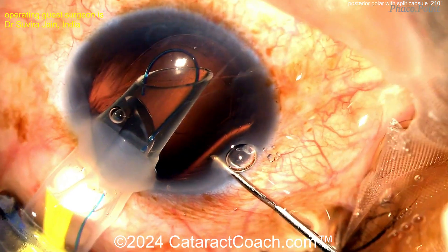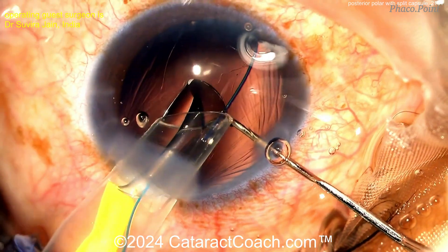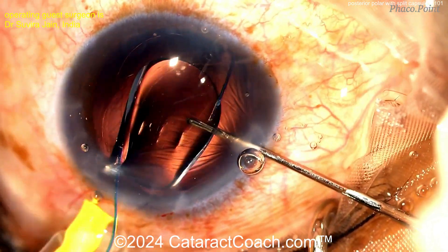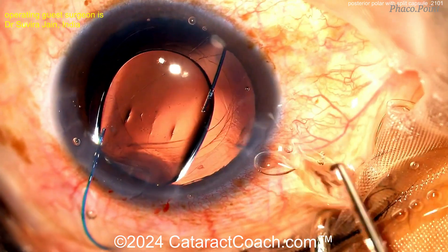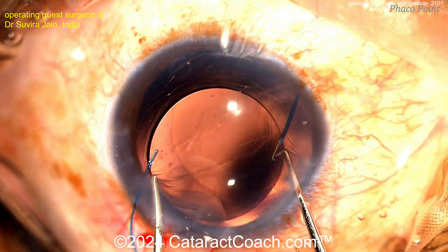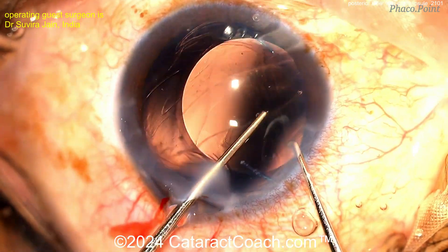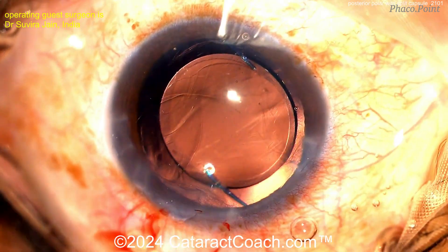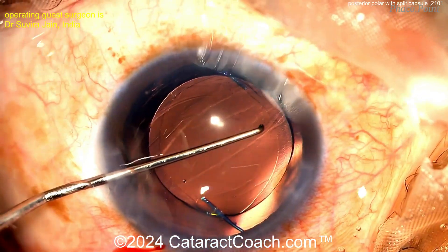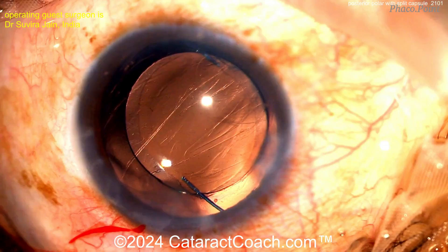Here comes a three-piece lens. The first haptic is going to go in the sulcus, then the optic is going to come out, and then placing the trailing haptic in as well. Beautifully done — nice control. We'll get those haptics in the sulcus and get that optic captured behind the rhexis. That'll give absolutely great long-term stability. It also acts as a barrier — by having that optic captured, it's going to prevent any prolapse of vitreous. You create a nice, good barrier effect there. Beautifully done.